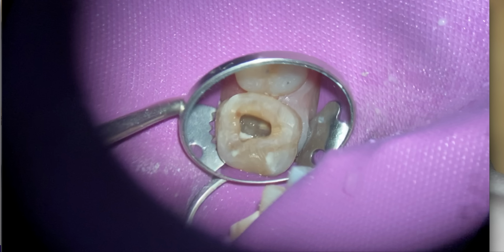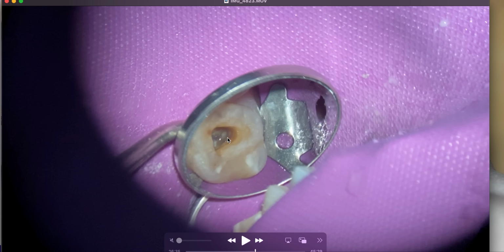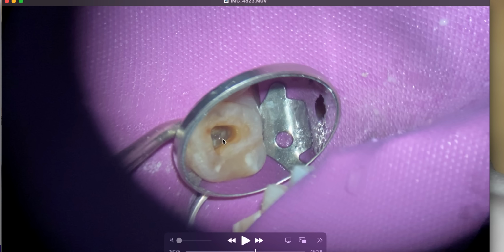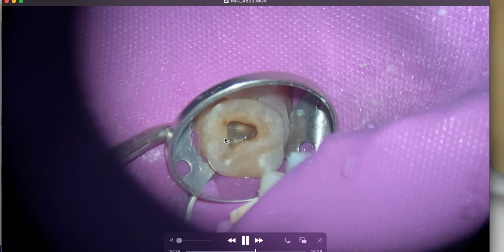I was going to not drill it out, but use my wave 1 gold, and that little piece of amalgam caused a little bit of havoc on my working length. Not this case, another case. So we're looking in here. There's our palatal canal. It looked actually pretty wet. Hard to say wet, but it was like this weird kind of color of liquid there.